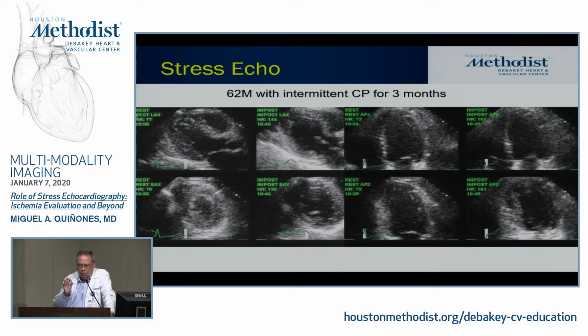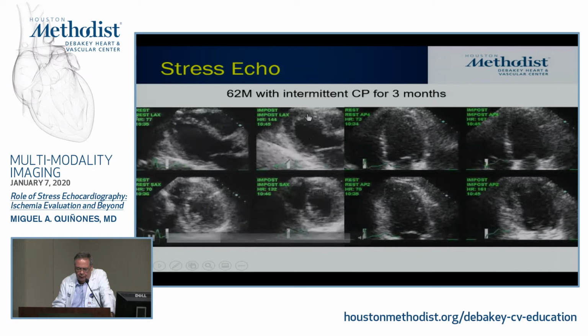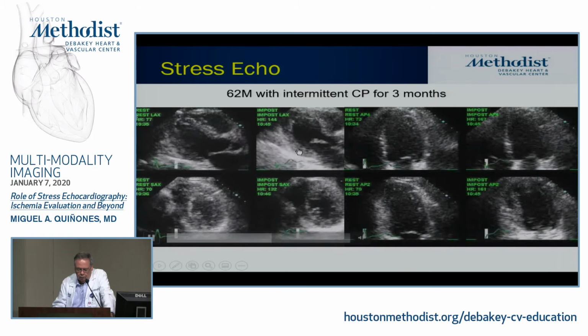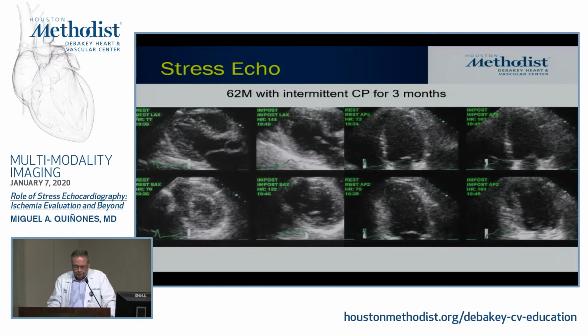And the eye picks that up very nicely. And when I'm looking at stress echo, I look for these findings even before I start looking at the actual movement of the walls, because these findings jump at you very easily. Okay?